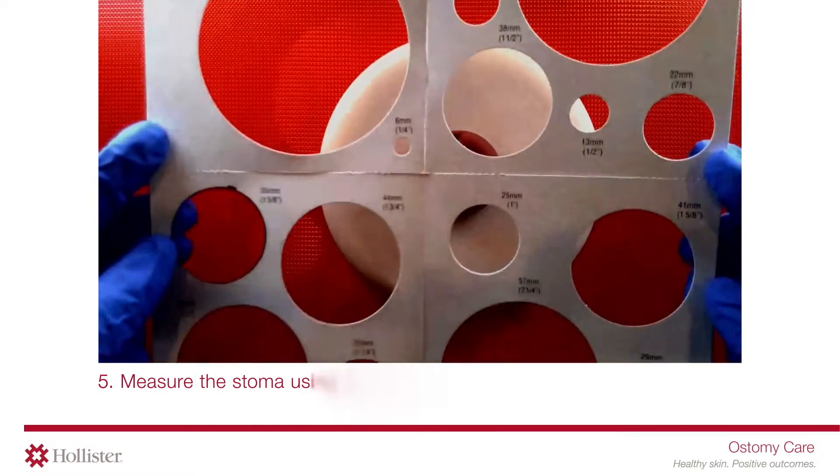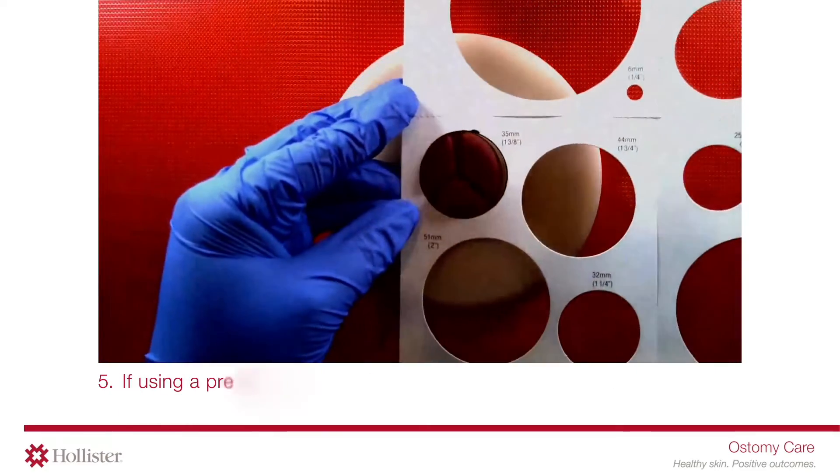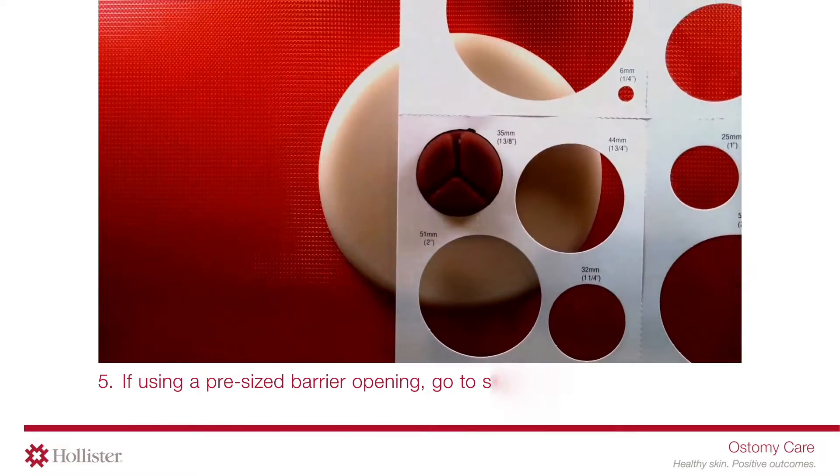Measure the stoma using a stoma measuring guide before every barrier application. If using a pre-sized barrier opening, go to step 7.